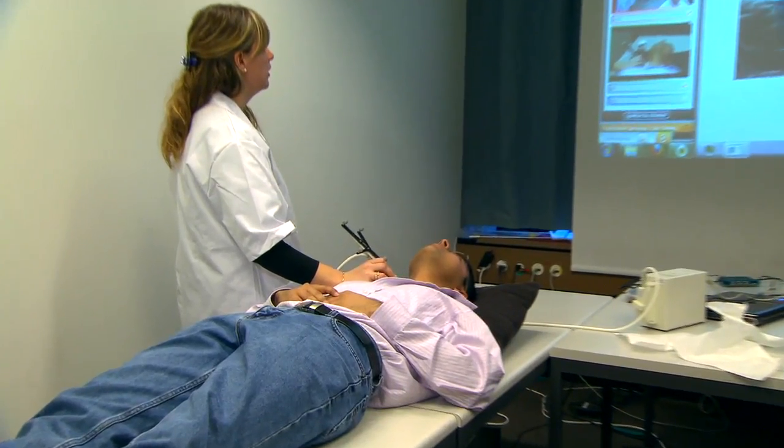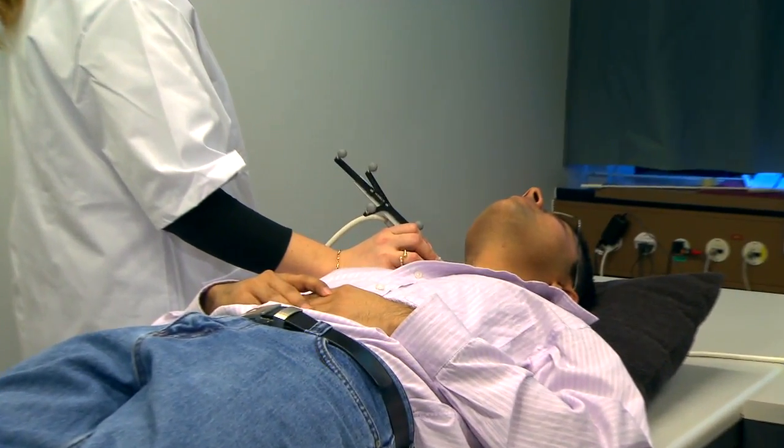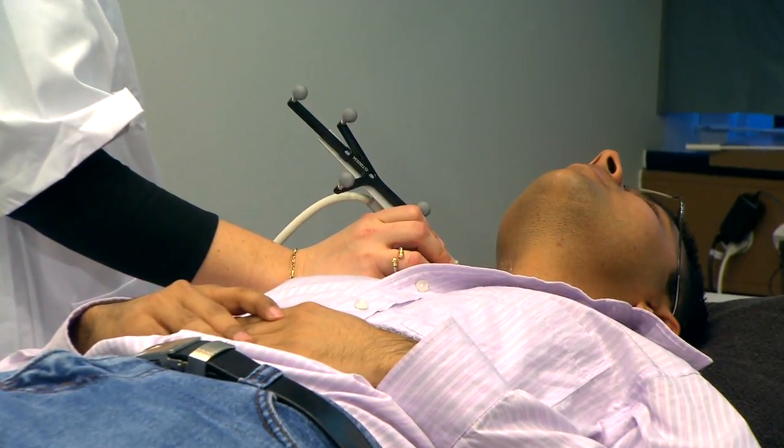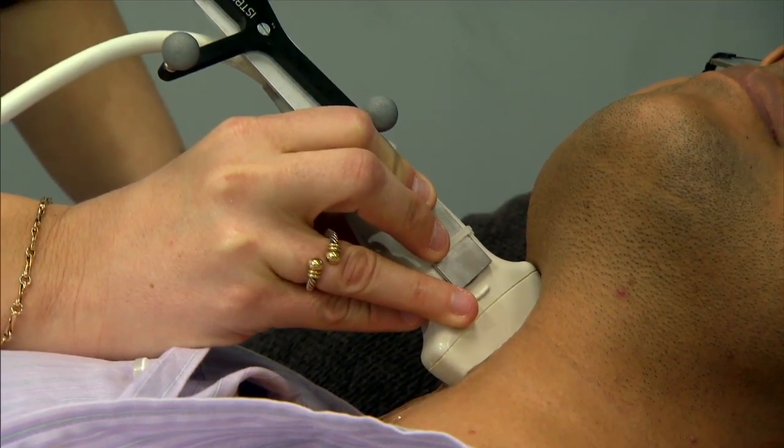Ultrasound imaging is a very interesting imaging modality, and for many indications — especially in emergency care, for instance in neurology — you can really diagnose neurological incidents. But to do that, you need the operator to be a real expert in the field, and this is not always the case, for instance in emergency or remote locations.